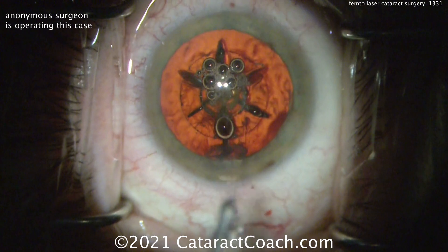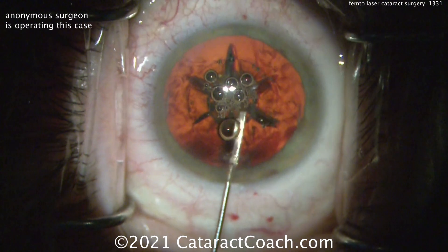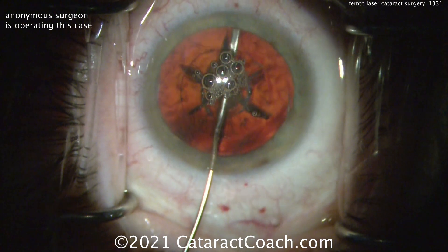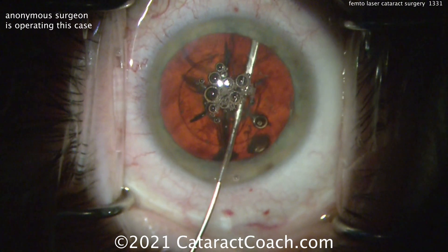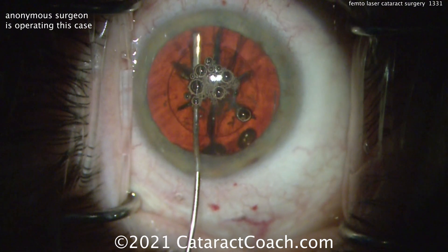And at this point there's some hydrodissection coming up to free that nucleus. Now in some of these patients, when you do the capsulotomy cut with a femtosecond laser, it actually cuts some of the anterior cortex edge there. So it can make cortex removal during IA a little more challenging, but really not that big of a deal.